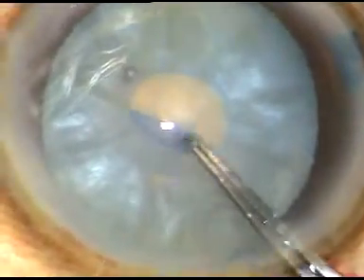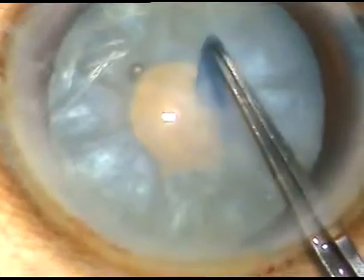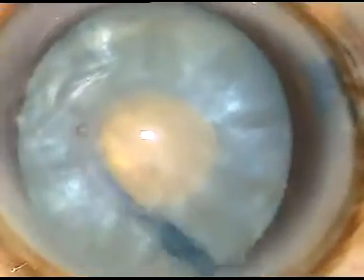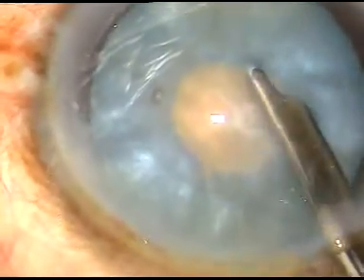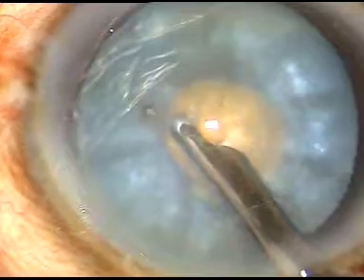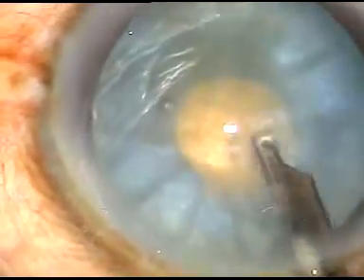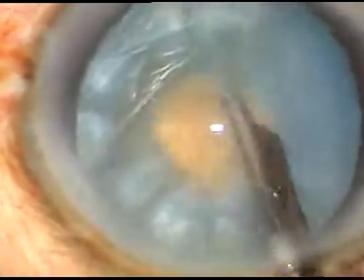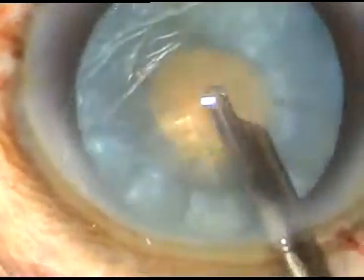Then a very small rhexis is made. Now, through this small mini rhexis, I aspirate some peripheral cortical lens matter. I can see the nucleus is rotating.